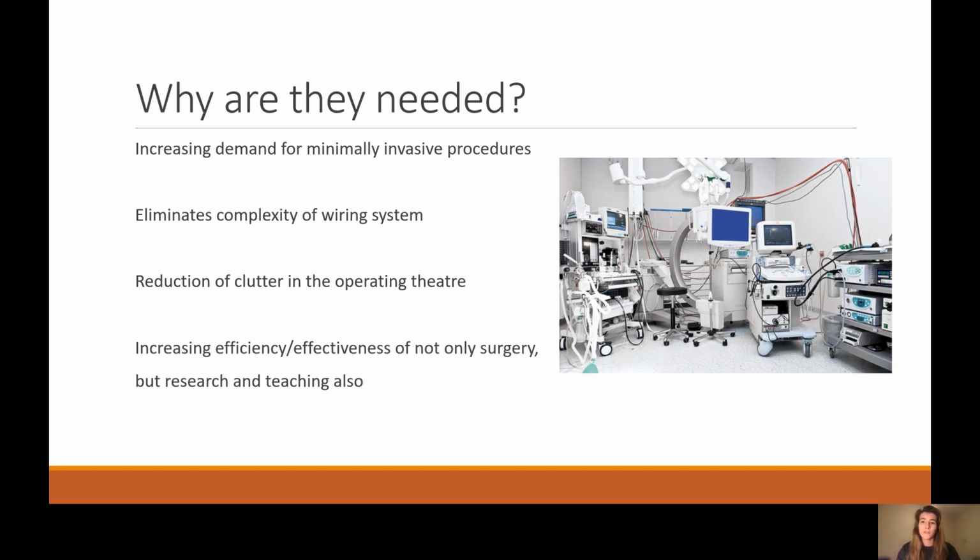This brings into consideration health and safety concerns, whereby wires and cables are running under the patient table, in the path of theatre staff, under the feet of the surgical team and anaesthetist, therefore creating trip hazards and increasing the risk of equipment being unplugged or damaged, all of which have the potential to disrupt the surgery. However, in integrated theatres, wiring and cables run inside the articulated ceiling arms for the lights and monitors. This means that there are no wires or cables running along the floor, allowing a smoother workflow to the surgery.